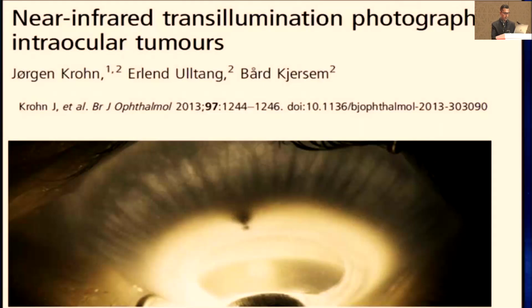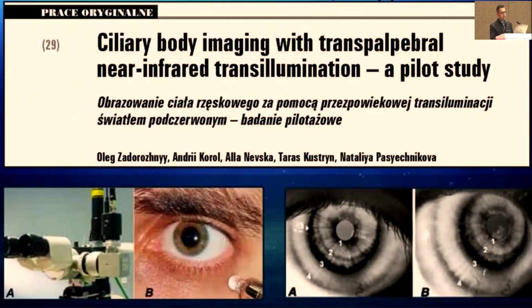So you can move from a blind procedure to an image-guided procedure, where you can now put this LED and the torch and then mark points where you want to fixate the IOL, or even, maybe, give an intravitreal injection. You don't have to do a blind procedure, and you can do a targeted procedure through the safe zone of the eye. It's not new. Infrared transpalpebral trans-illumination has been published for seeing intraocular tumors, and sometimes for some glaucoma procedures, but it's never really been used for any fixation techniques or any image-guided surgery.